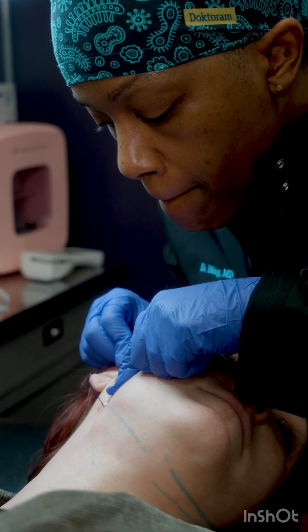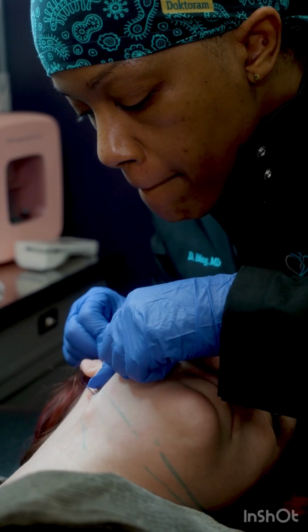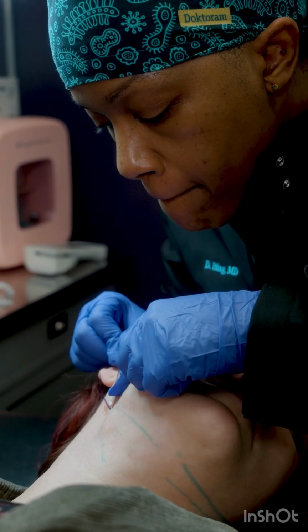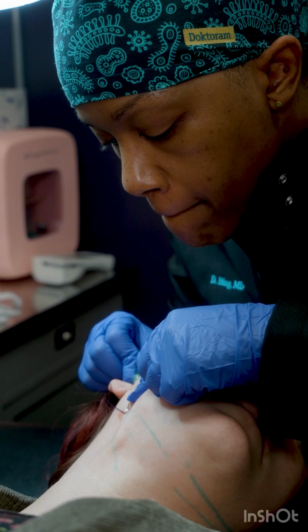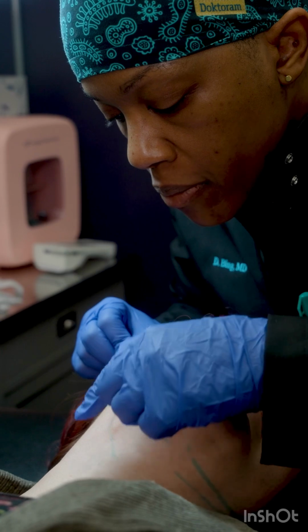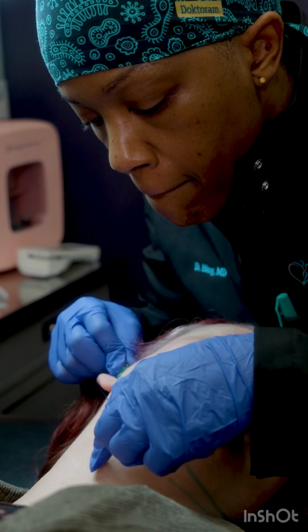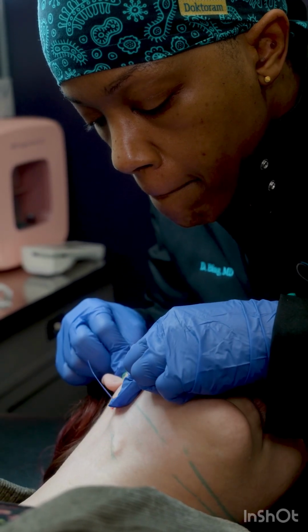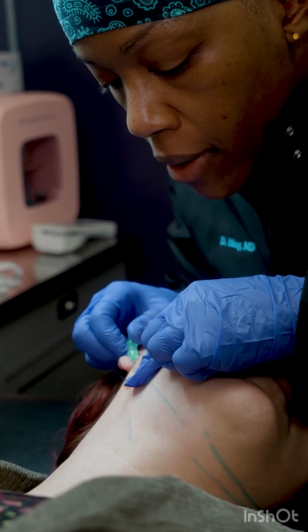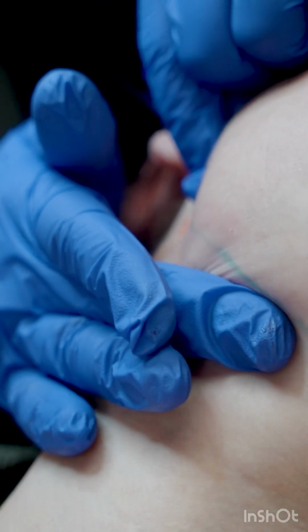The steps are completed for the additional areas of treatment that were demarcated on this side of her neck, and I continue to insert the PDO threads, carefully following the track that I marked prior to starting. I'm constantly checking my place to make sure I'm in the right plane, and also that there are no complications or issues arising as I insert the thread carefully into place. Once I reach my final destination with the thread, I will twist again and pull out. This helps to lock the threads in place.